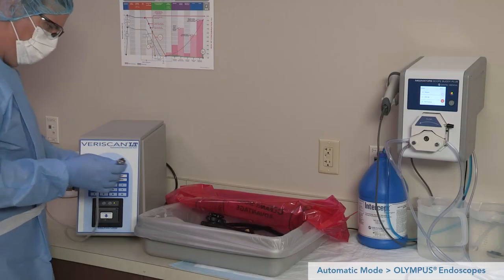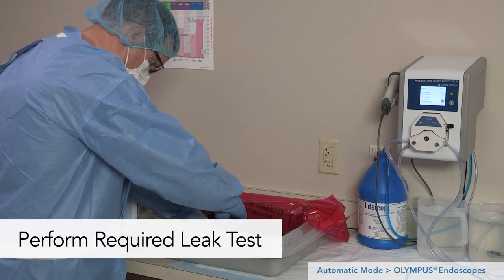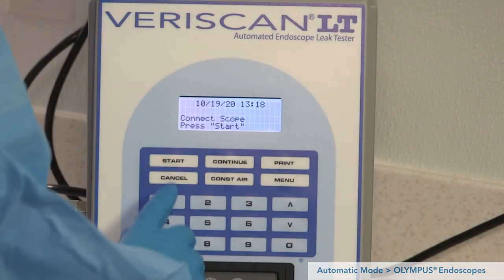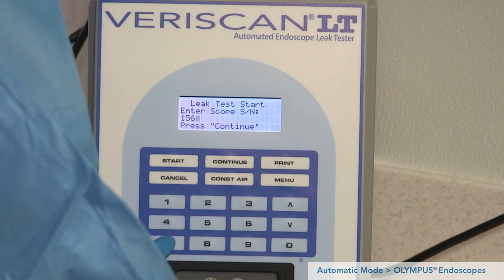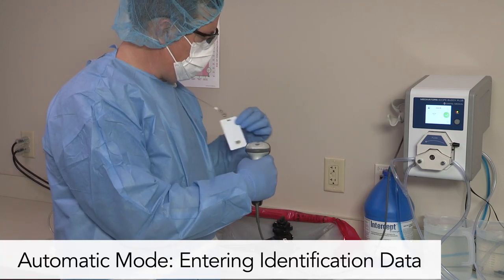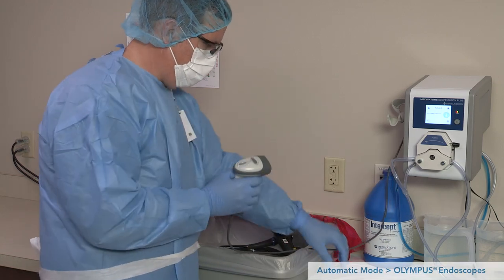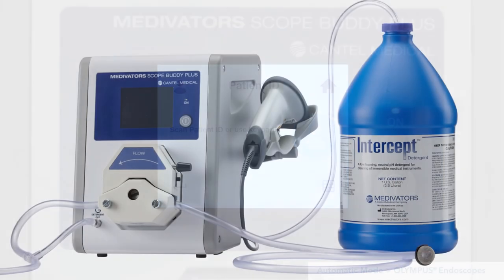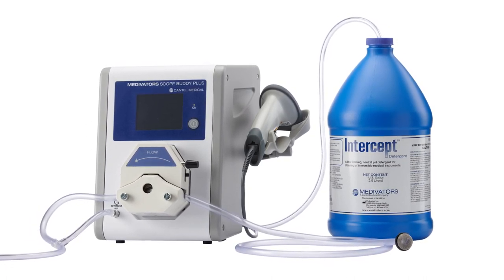Prior to connecting the Scope Buddy Plus Flushing Aid to an endoscope for flushing, ensure the endoscope has been leak tested before submersion for manual cleaning as part of the overall reprocessing protocol defined in the manufacturer's IFU. At the beginning of every cycle, users are prompted to enter the identification numbers for the user, endoscope, and patient if enabled, via the barcode scanner or manually by selecting the keypad icon. The Scope Buddy Plus Flushing Aid can be used to dose detergent to both the sink and clean container prior to brushing and flushing the interior endoscope channels. Do not connect the endoscope until the detergent dosing is complete.